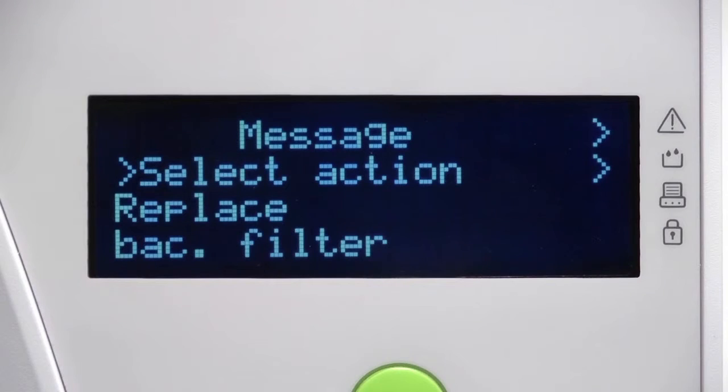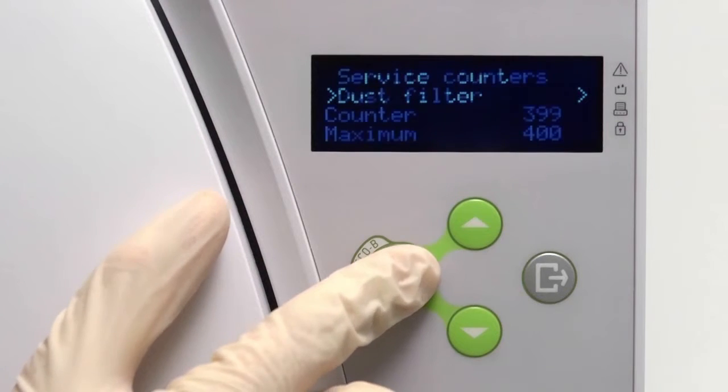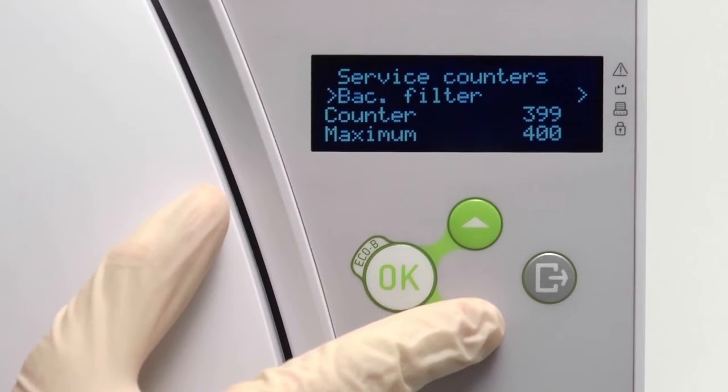Your Liener steriliser will automatically prompt you when the life of the bacteriological filter has expired and needs to be replaced. Alternatively, you may view the number of cycles completed by the filter from within the service counter screen of the menu.